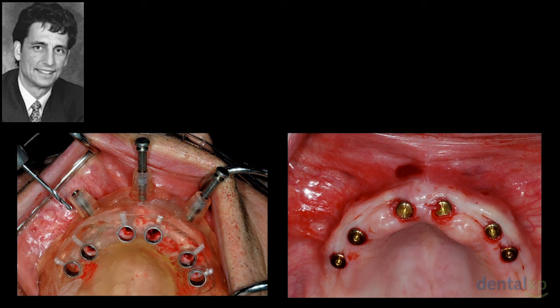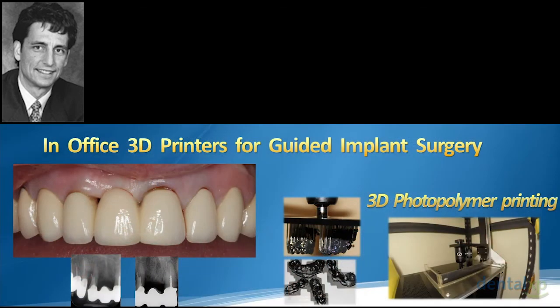Placing our implants took less than an hour, with very little trauma at all to the patient, and it was one of those situations where we did have enough bone and enough soft tissue and we didn't have to reduce the interarch bone. Again, we don't see that on a regular basis. Most of the time there are adjustments made.